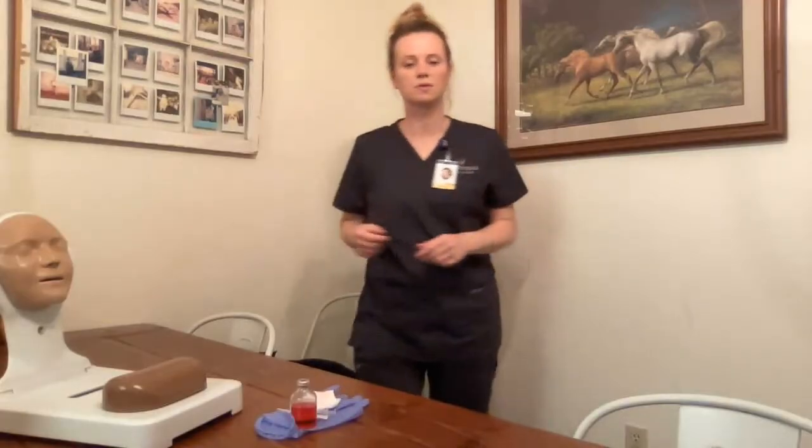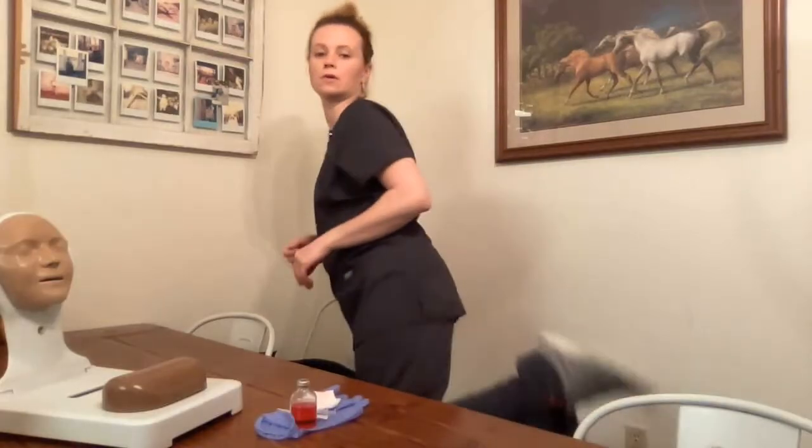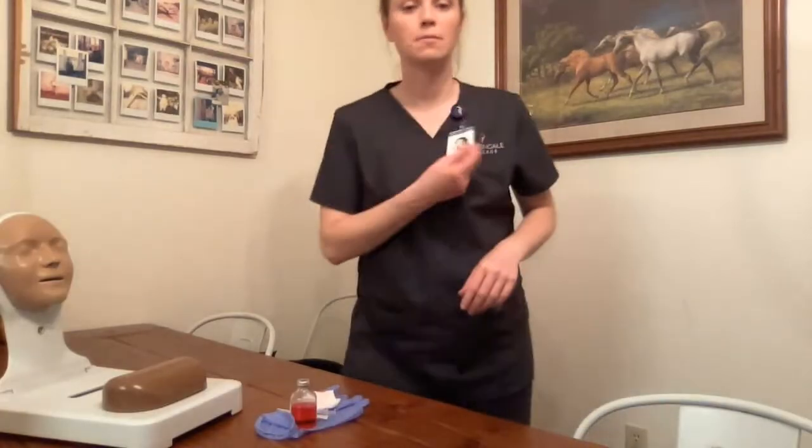Hi, my name is Emily. I'm going to be performing the skill video Administration of Intramuscular Injection. I'm in the appropriate school attire, wearing shoes, badge is visible, no polish, no acrylic nails, nor jewelry.